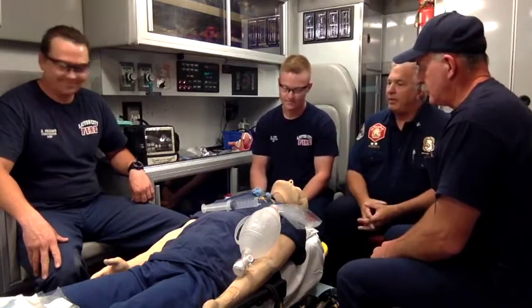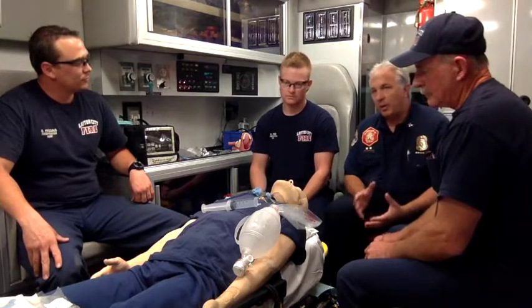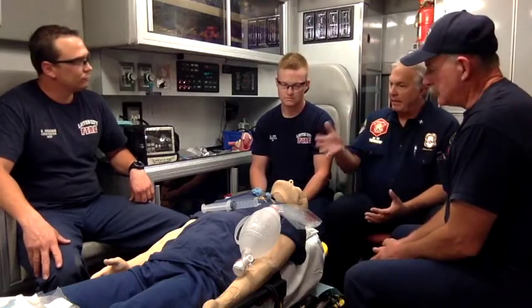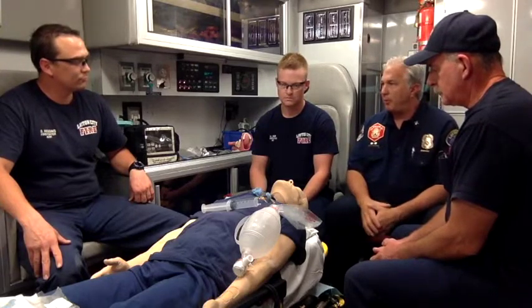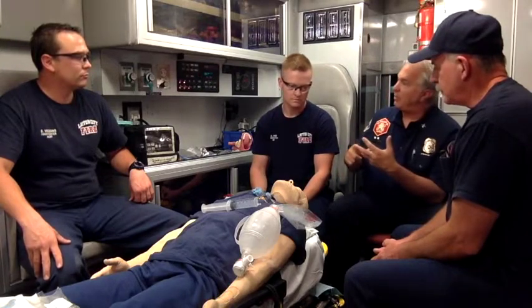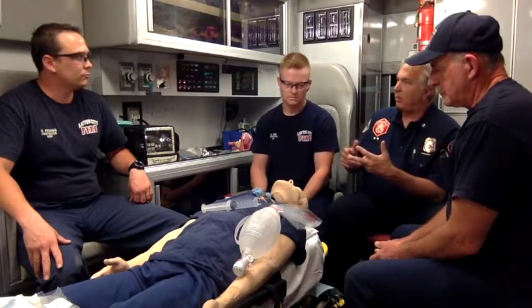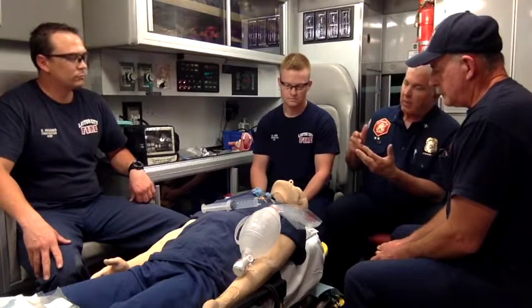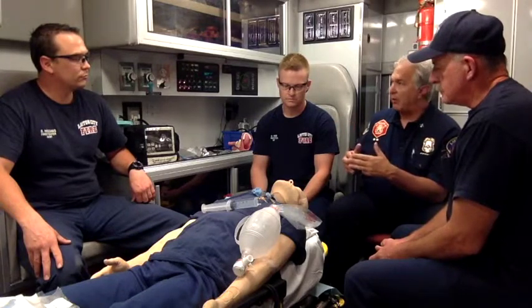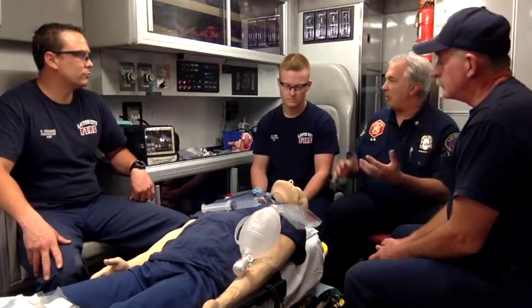I agree. And if you look at some of the literature about this, we as paramedics get fixated on intubation, and we all know that that's bad. In fact, that's why these devices have become so popular in EMS systems: we tend not to be great at intubation. We tend to interrupt CPR, which we know we shouldn't, and this is where this is going to get used a lot. I can prove statistically that our department is certainly better than the norm, but we still have occasions where I truly believe this is the smarter thing for us to do.